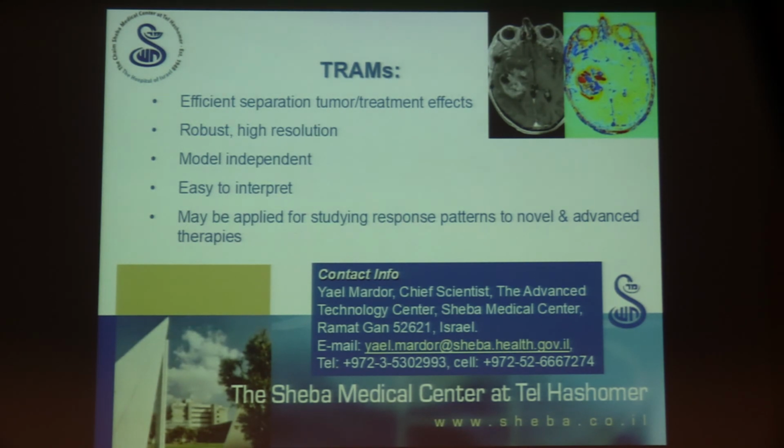It's robust because we're using standard 3D-T1, whatever you use in your hospital. It's model independent. We just subtract two images. We don't make any assumptions. And it can be used for planning high precision treatments such as SRS or implanting a catheter or biopsying blue regions, etc.